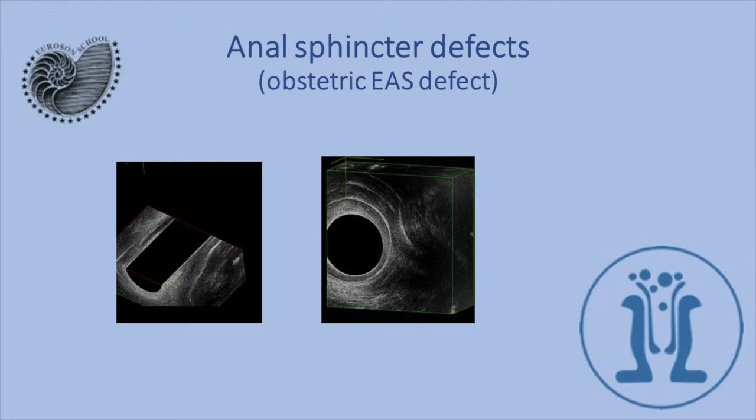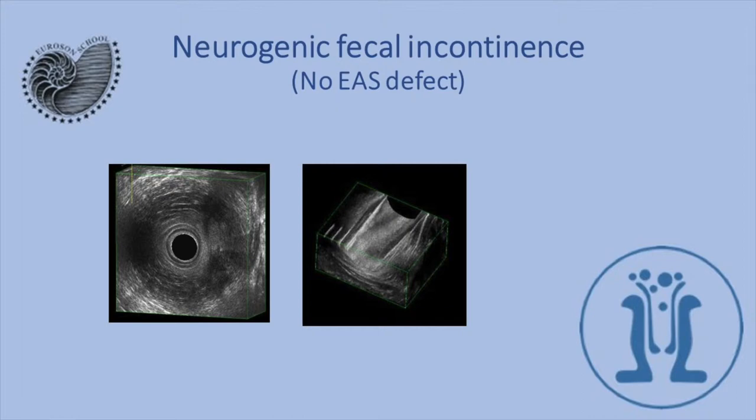Here we see an older woman with fecal incontinence. She has fecal incontinence but the external anal sphincter is intact. This is because of a neurogenic defect — there is no sphincter defect that could be attributed to delivery.